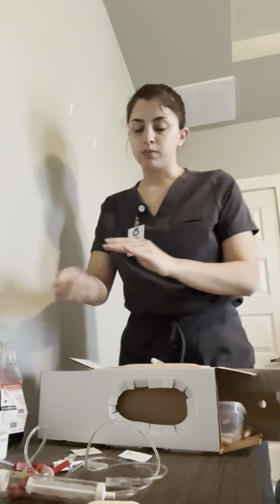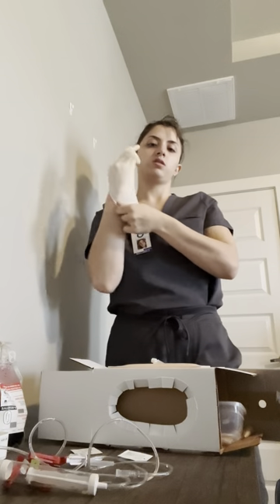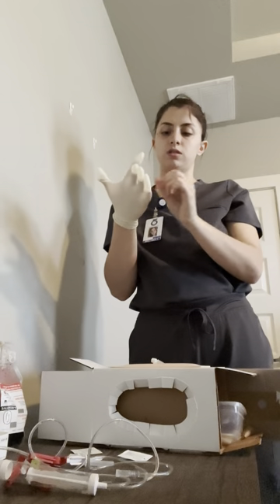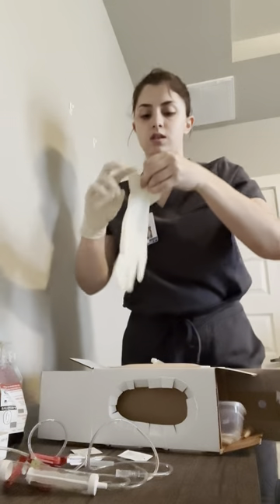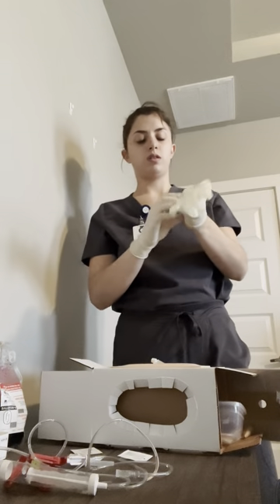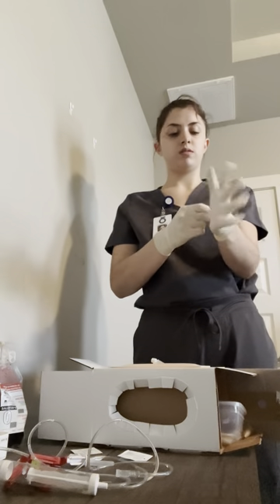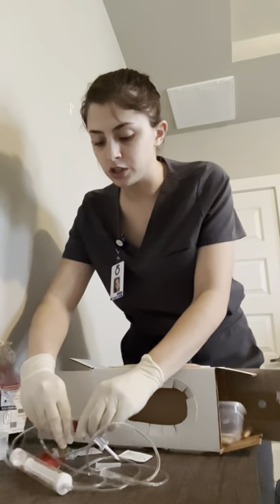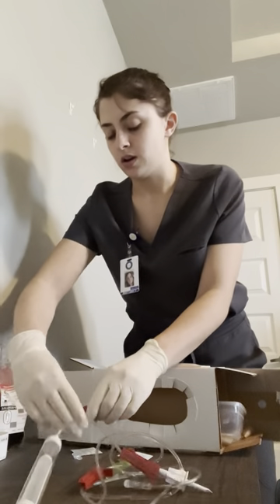Once I've done that, I'm going to perform hand hygiene and check my tubing and make sure that there is a filter, and there is. So then I'm going to don the gloves, and once I've got my clean gloves on, I'm going to make sure that every clamp is shut completely on my tubing, and all of them are.